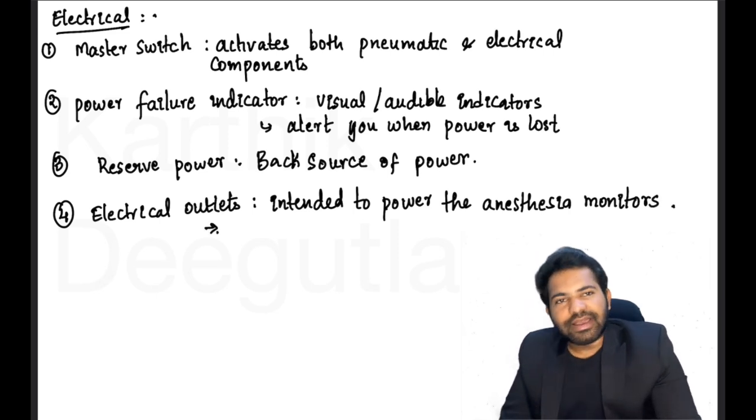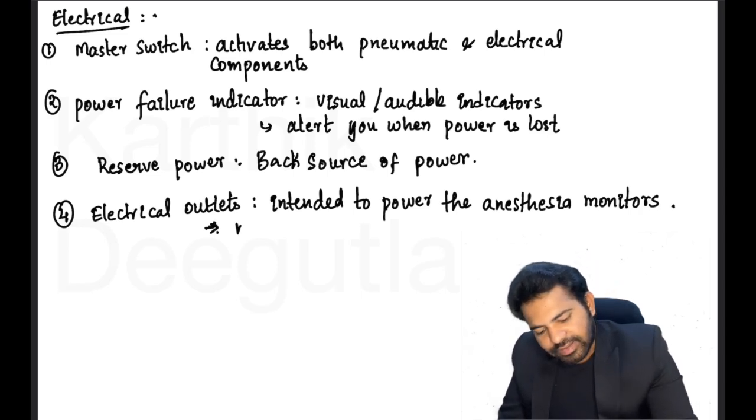The other machines like the ultrasound machine or any other appliances have to be connected directly to the main power source and not to the anesthesia machine. Okay, this is not for other appliances.